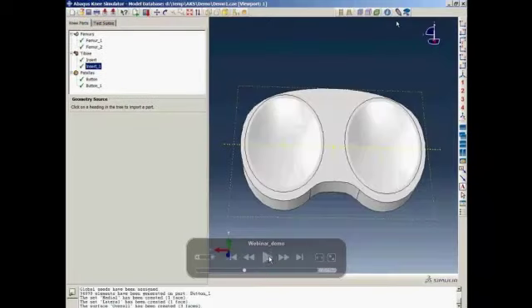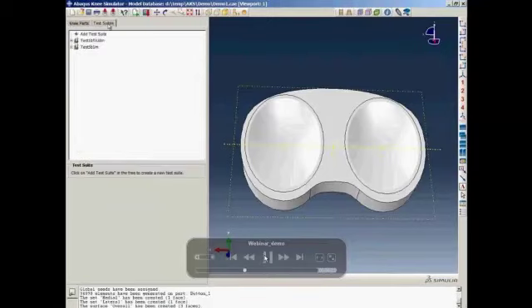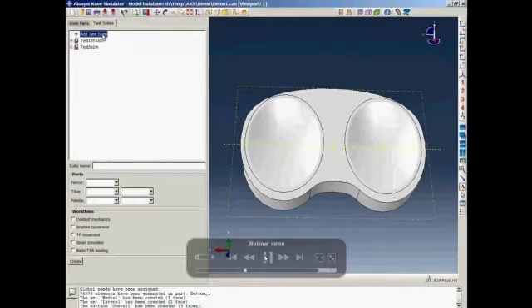Now we go back to the knee simulator designer mode by first going back to the knee simulator module and then click on the designer icon. Now we're back to the beginning of the demonstration where the interface mode is. Next, we demonstrate how a test suite can be created.